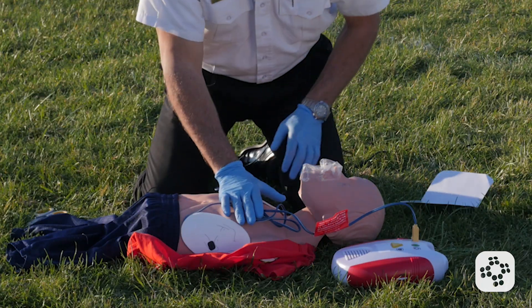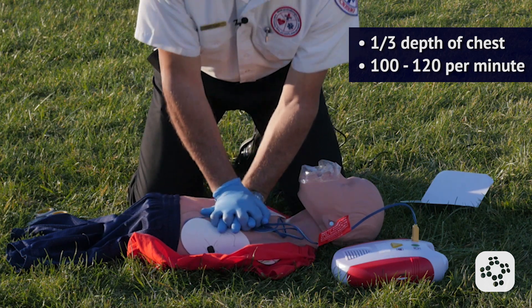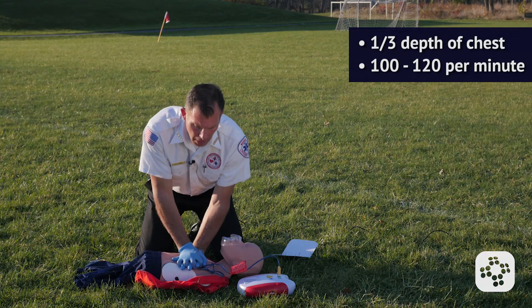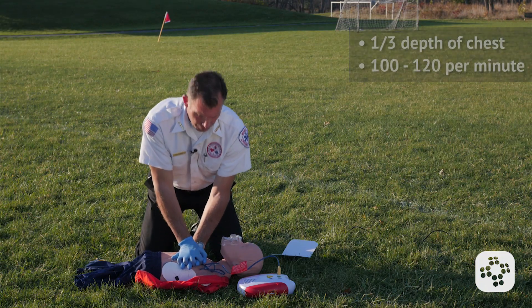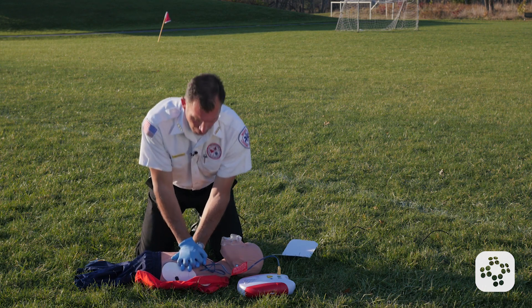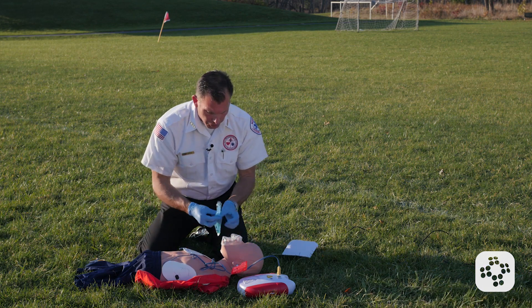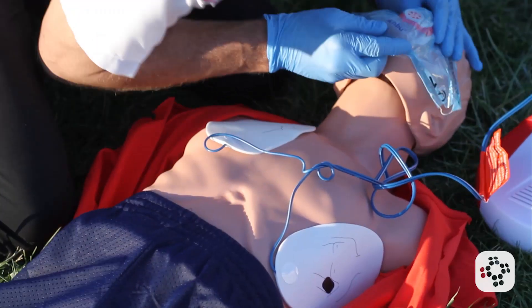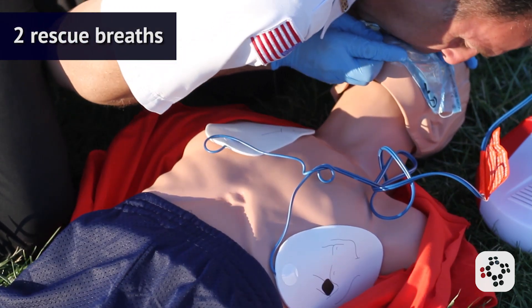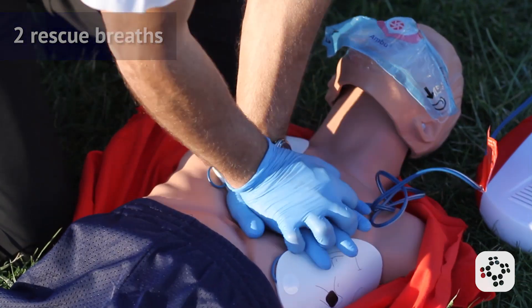Begin five cycles of CPR. If it's a large child, I'm going to go with two hands and do compressions to a third of the depth of the chest, 100 to 120 times per minute. After my 30 compressions, I'm going to go ahead and get my CPR shield, give my two rescue breaths, then go right back into the chest compressions.